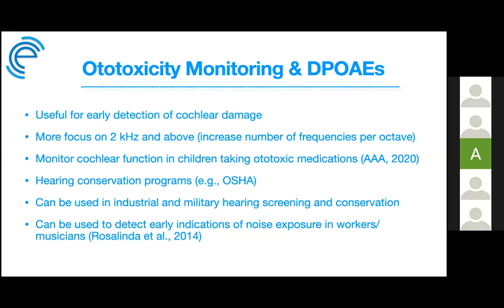I'm not going to go into a lot of detail on this for the sake of time, but if you're interested, there's a very good study about the early detection of ototoxicity with DPOAEs, and it was done by Fausti in 1999. I can send you the link if anyone's interested.